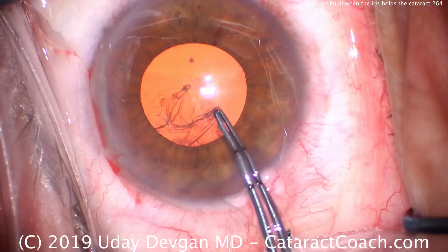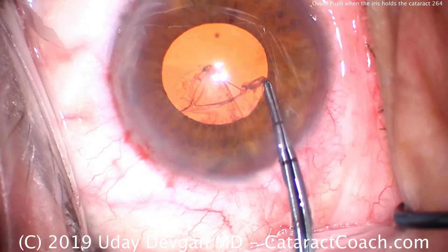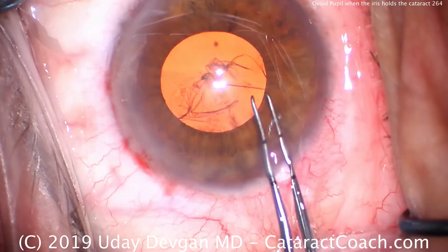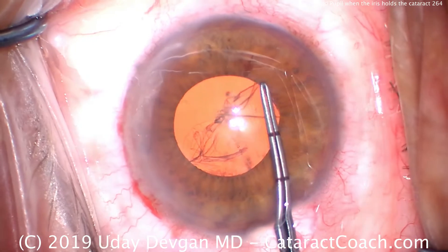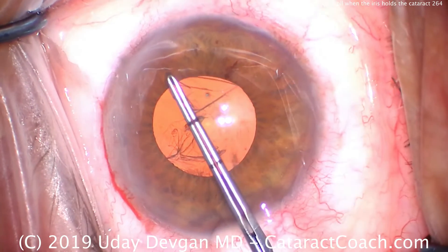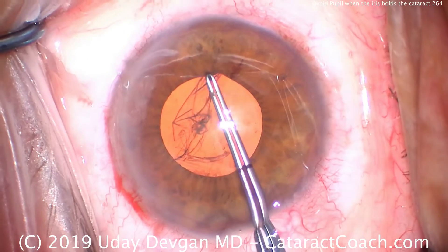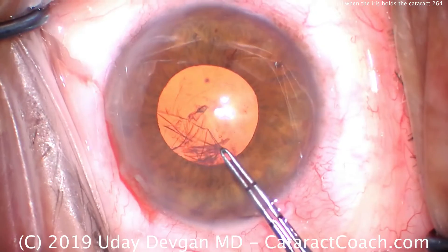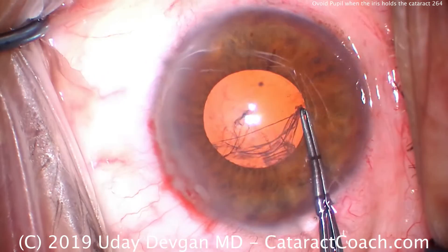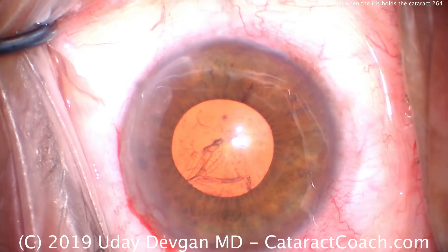We'll do this brown eye first. Notice that we're making the capsulorrhexis larger than the pupil, so the edge of the rhexis is actually under the iris. We don't need to see it directly — you know where it is; you've done this thousands of times. Even though the pupil is four millimeters, let's make a five or five-and-a-half millimeter capsulorrhexis.